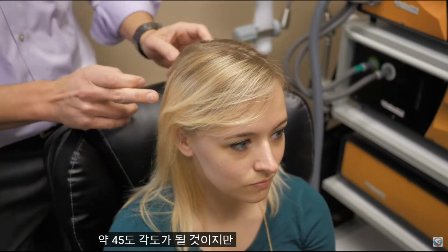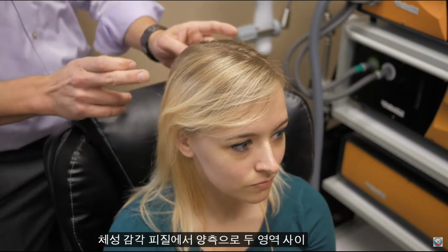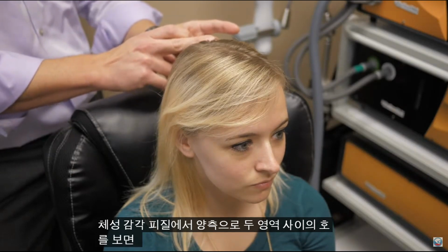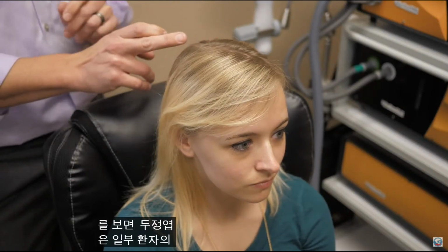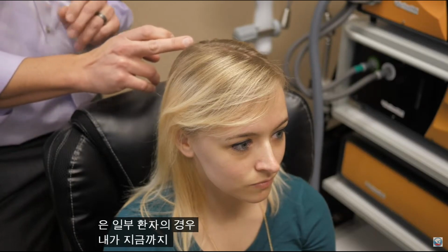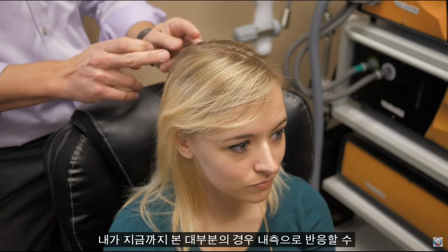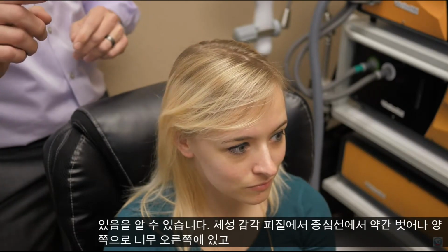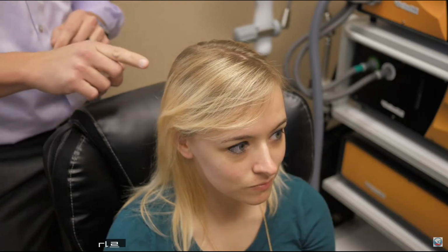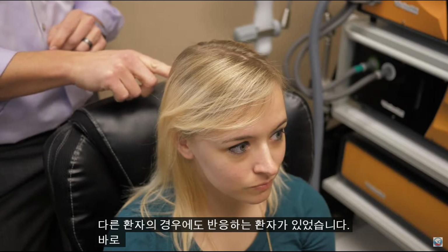However, if you look at the arc between those two regions bilaterally in the somatosensory cortex and the parietal lobe, you'll see that for some patients, they may respond medially. For most that I've seen so far, it'd be somewhat off the center line, and so bilaterally right there in that somatosensory cortex. And then for others, I've also had patients that respond well just medially in the occipital lobe.